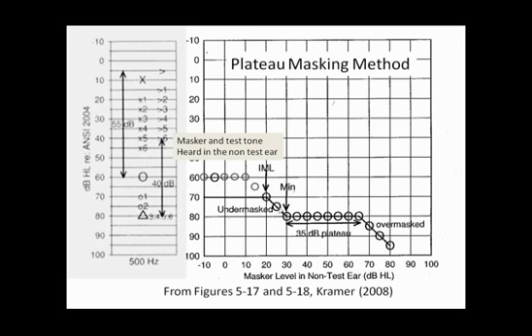Okay, that's great. So when the tone was presented at 60 dB HL with no masking noise, which ear heard the tone? Well, we know now that it must have been the left ear, because as soon as we added just a tiny bit of noise to the left ear, the patient no longer responded to a tone delivered to the right ear at 60 dB.